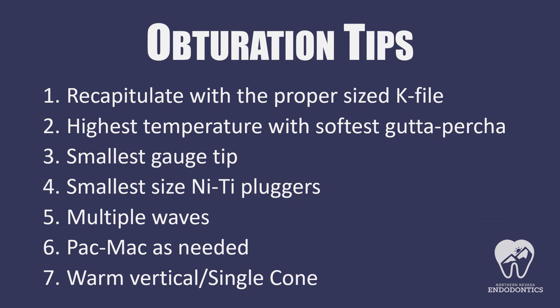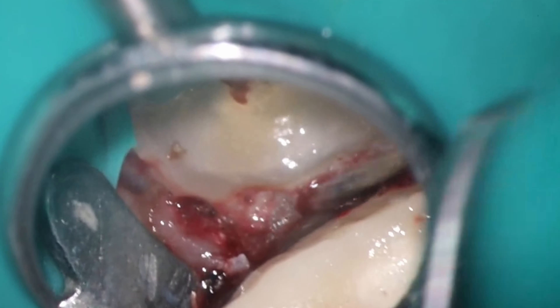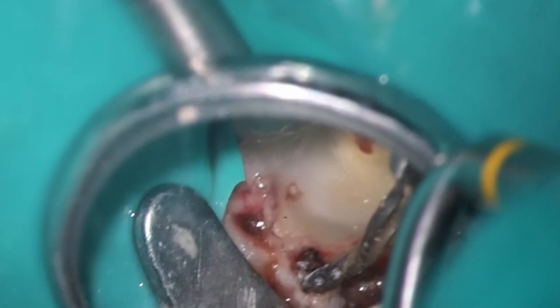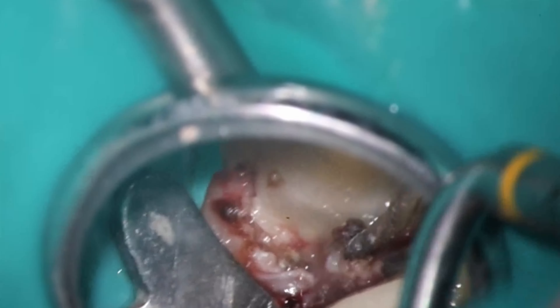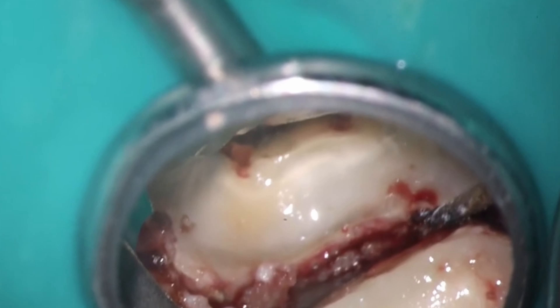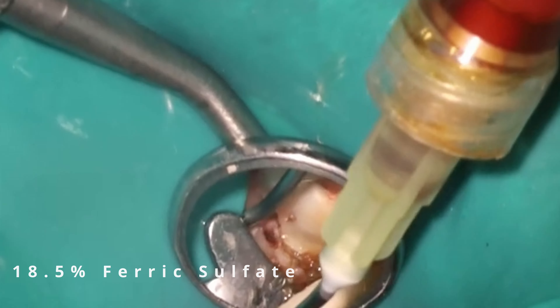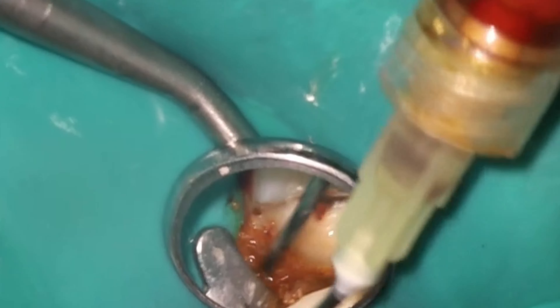Let's finish this up. First thing we need to do is control that bleeding here — the gingival tissue was very upset after I had removed the blockout material. What we're going to do now is use the alpha to cauterize, stop bleeding, and remove a little bit of it as well. I always get the patients a proxy brush at the end of the appointment when I do this, and it makes it very easy for the general dentist to go back in and get a beautiful margin down there with really healthy gingiva. If you leave it in this inflamed state, the gingiva is usually going to stay inflamed. What I've found is that when you remove it like this, it actually just creates beautiful healthy gum tissue. After we've removed all that, go ahead and clean it up a bit more with some ferric sulfate just to stop any little bleeders, and we are pretty much ready to start the restorative process.